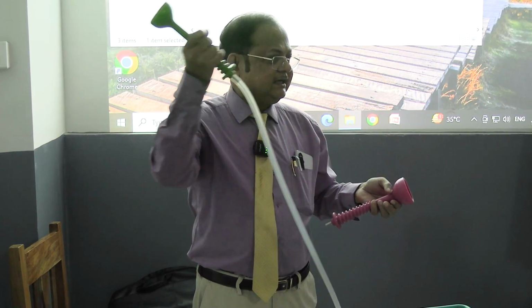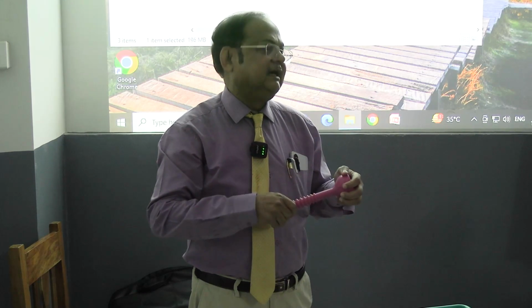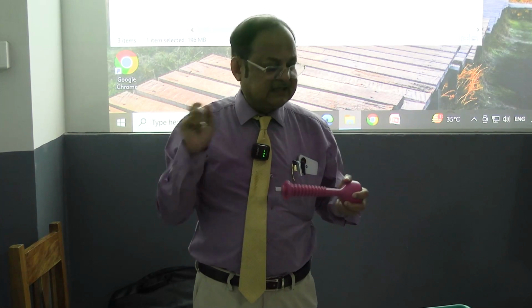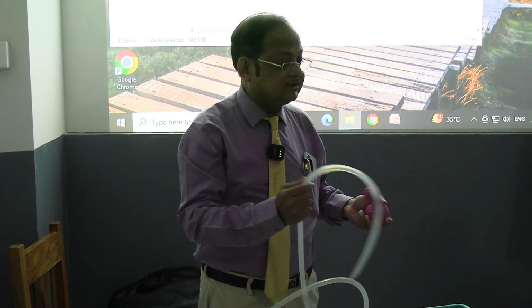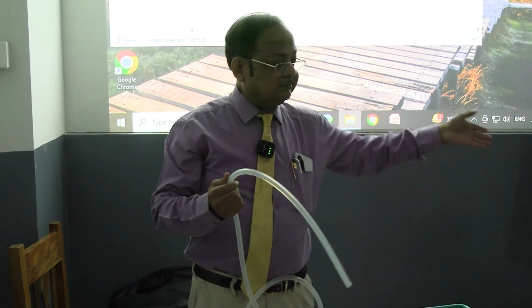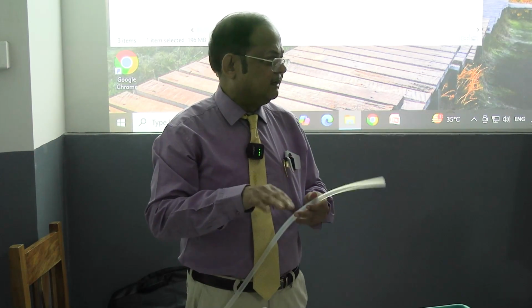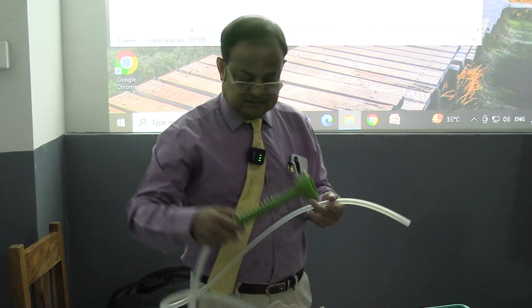When you are given this in the exam, you will say this is the ventouse cup with the handle. It's simple. What is its function? Before that, I am saying what is done actually. Yesterday the machine was here. In our college there is a newly arrived machine, the ventouse with an electric pedal pump. This is a very good model, that is useful.